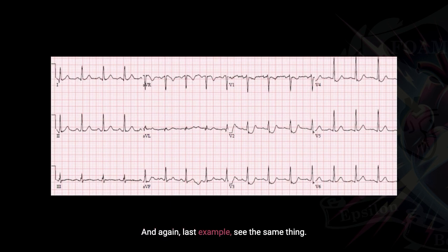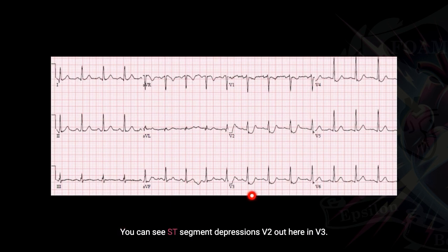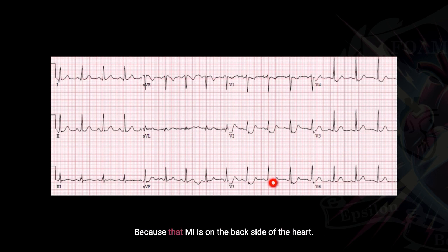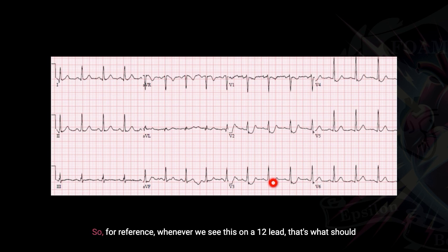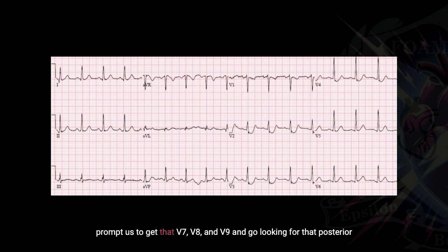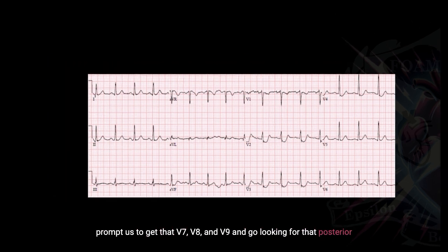One last example — you can see the same thing: ST-segment depressions in V2 out to V3, because that MI is on the backside of the heart. So for reference, whenever we see this on a 12-lead, that's what should prompt us to get V7, V8, and V9 and go looking for that posterior STEMI.